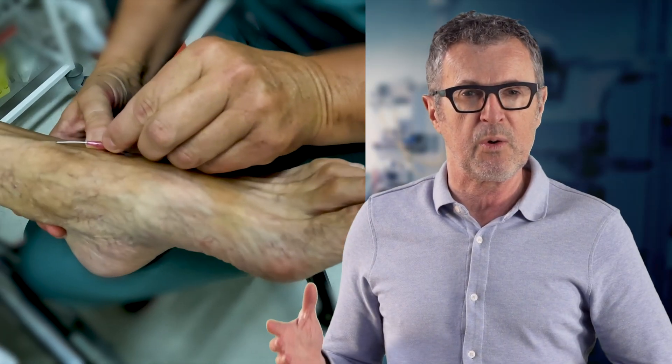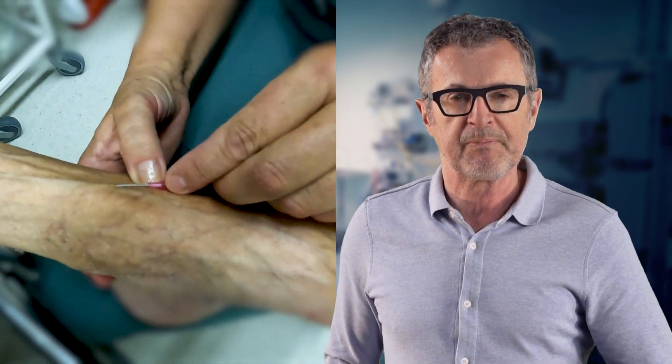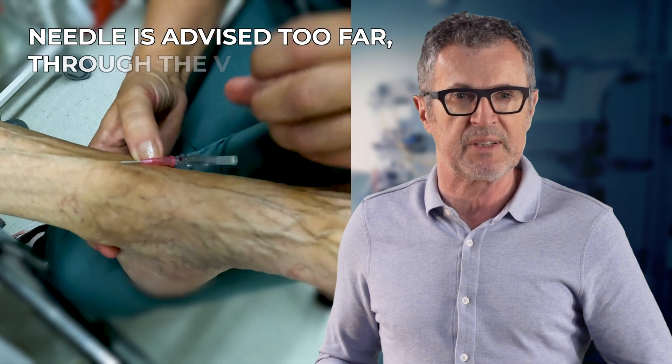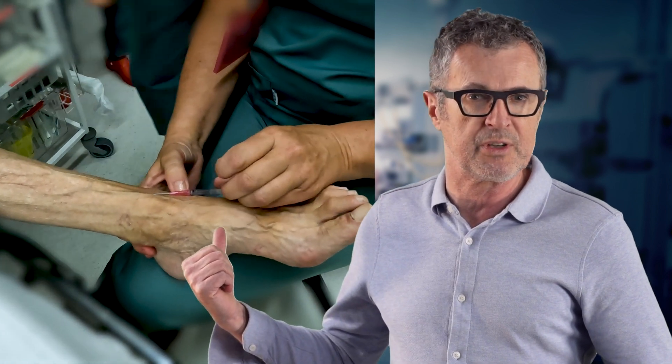In this video we will see a failure to insert the catheter into the vein of the dorsum of the foot, and what to do to fix it. We can see a speck of blood in the chamber, but the operator has missed it and advanced the needle further through the vein. So now the needle is posterior to the vein, which is the problem.